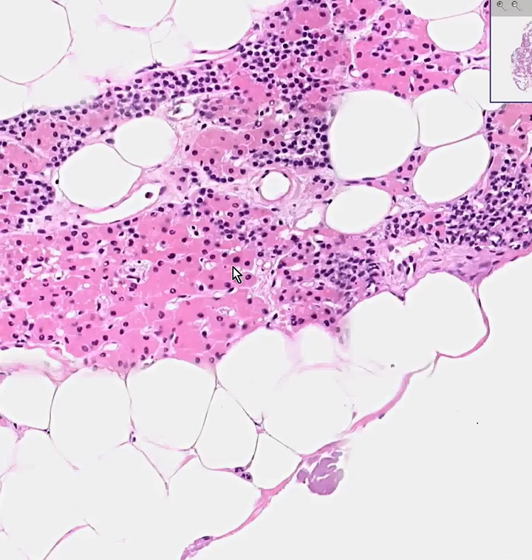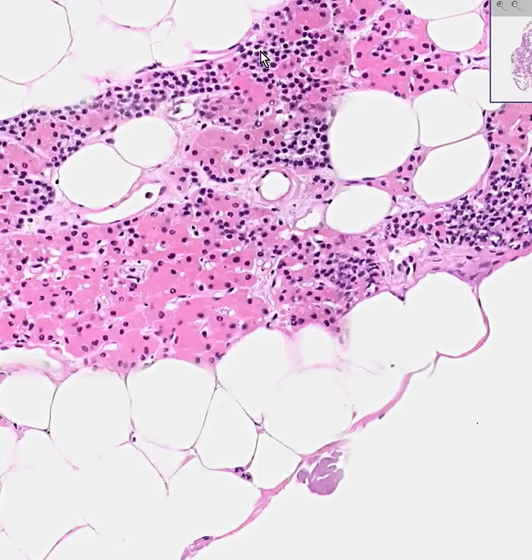So let's forget about the pathology and just say this is the world's most classical parathyroid gland, having a lot of oxyphil cells here and a lot of chief cells here, and a few chief cells and a few oxyphil cells there. There's really nothing more to say except thank you.